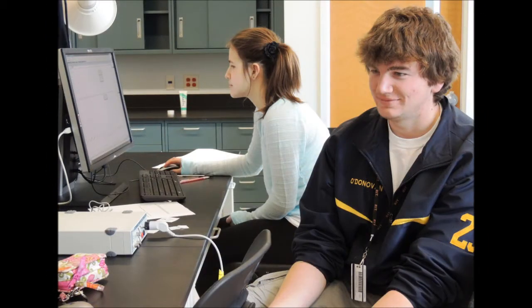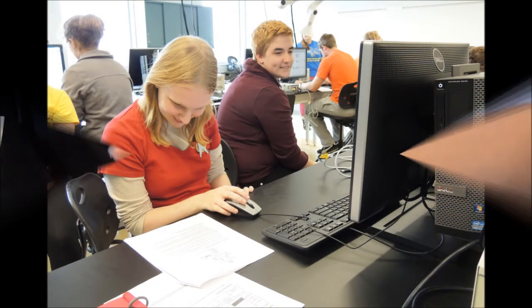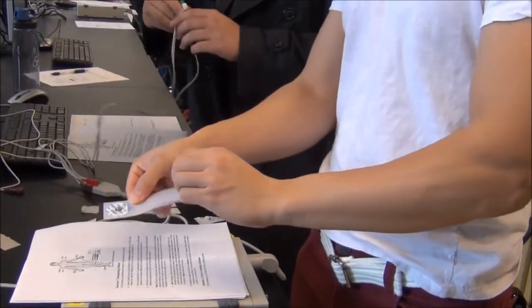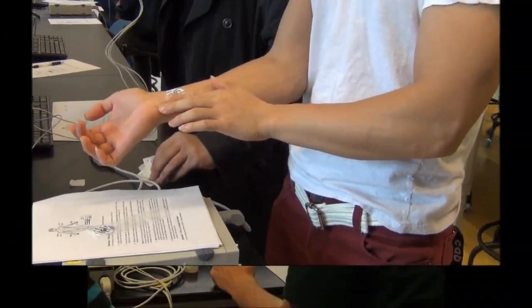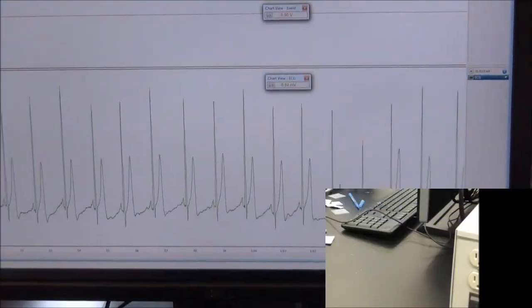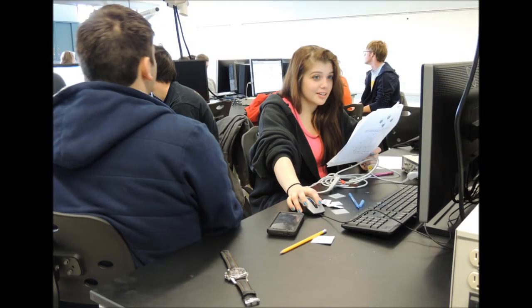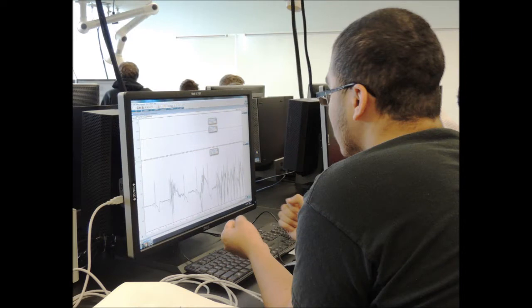In the heart ECG and sound demo, students will learn about the electromechanical structure of the heart. They use a modern ECG and heart sound recording system and record a digital representation of these phenomena in the PowerLab software. They then measure ECG signals as the electrical properties of the heart, and heart sounds as a measure of the mechanical structure of the heart. Students measure ECG in both relaxing and movement situations to see how artifact affects the ECG data.